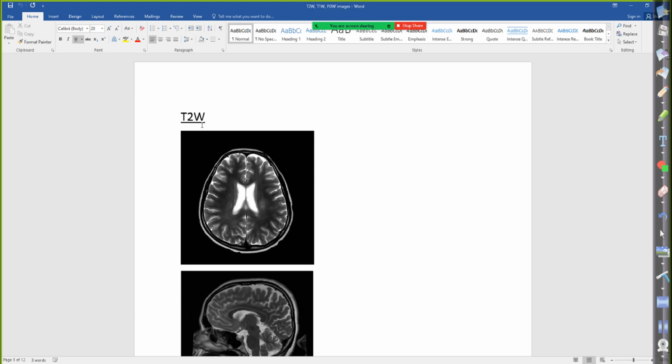So our T2 weighting. In essence, fluid should be bright and fat should be dark, but we know most T2 weighted images, just because they're usually longer sequences, because their TRs are a little bit longer, and we've designed it so that we shorten the time up by doing something called a fast spin echo, and we'll get to it. But with that fast spin echo, it bumps up signal from fat as well, so fat also appears bright. So always, always, always go to the fluid first. I can't stress that enough.